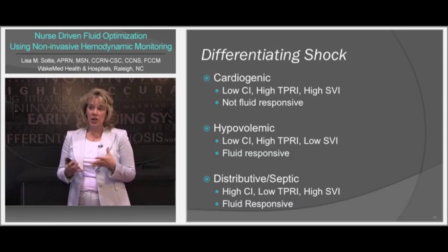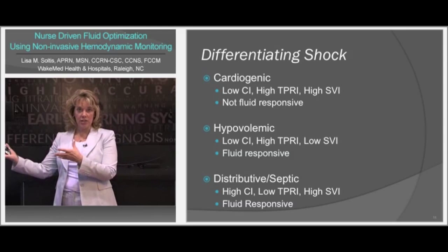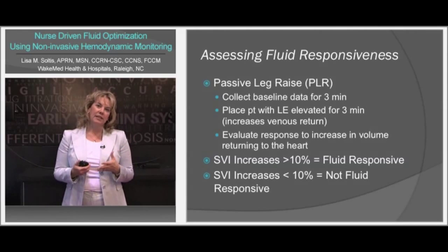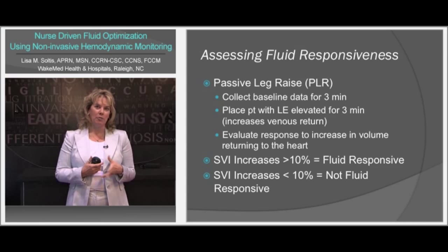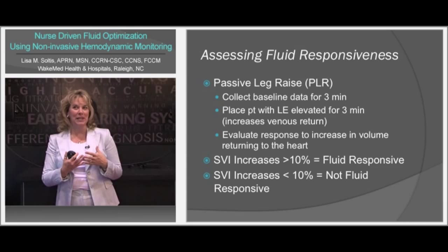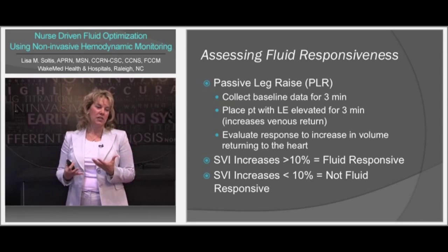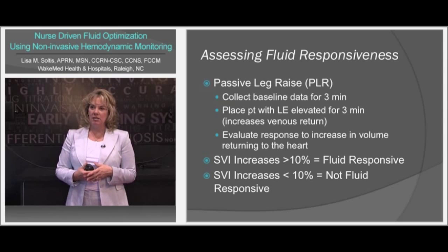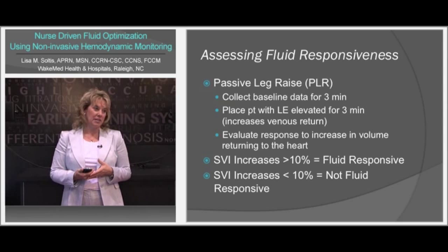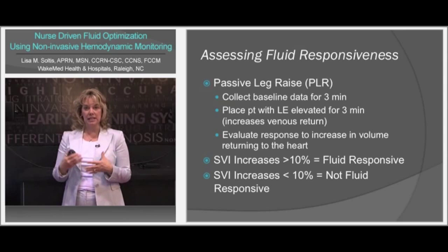So eventually their cardiac function is going to diminish over time because their heart can't keep that up. So assessing fluid responsiveness, again, we go back to, in healthcare, everything that goes around comes back around again. A very simple technique that we've been utilizing for years and years is now coming back into the forefront as far as how we care for our patients, because it's a very simple test that we can do. And now with our non-invasive technology, we have the ability to assess their responsiveness and assess, do they need that volume?